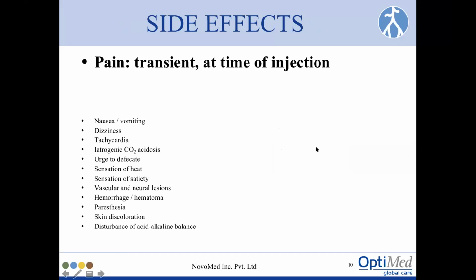The side effects, a lot has been written about the side effects. I've been doing carbon dioxide angiography from 2014. Though all these side effects are theoretically there in the books, I have done loads of these procedures using carbon dioxide.